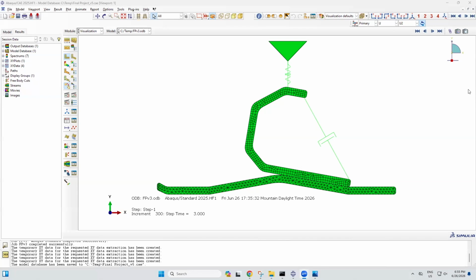Hi, I'm Brigid Teaken. I am in the Finite Element Analysis class for the summer of 2026, and I'm modeling a foot prosthetic's deformation when a person is just standing on it. I use 2D deformable shell elements to simplify the model. It includes 3 different parts. This is what we will end up with.